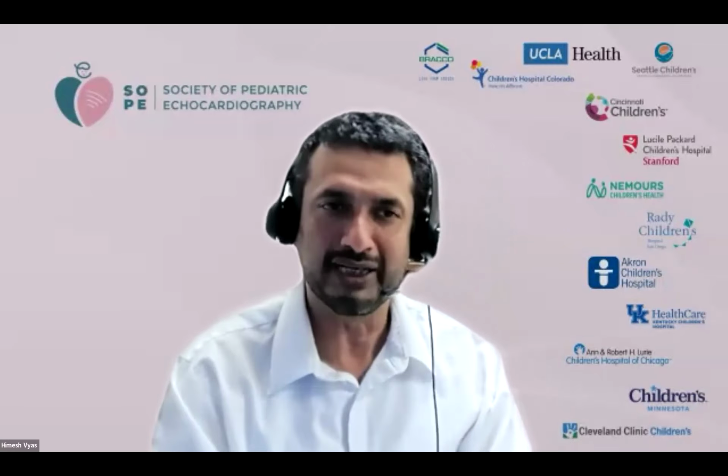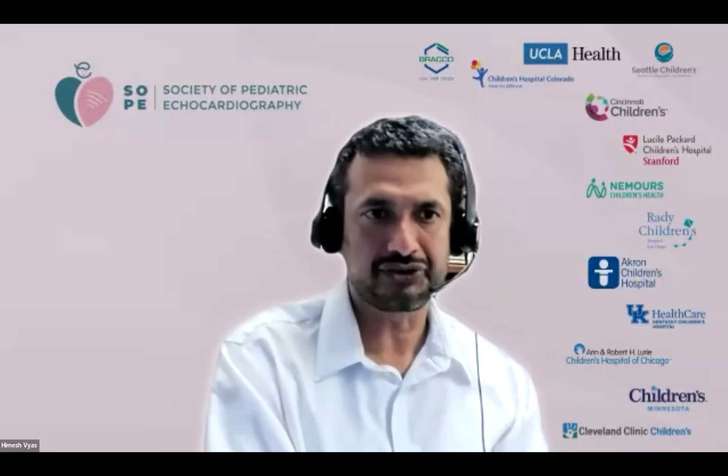Certainly, I'm sure Mike would be a great resource for that. But in my opinion, we tend to have a very low threshold to move from one modality to another. For example, if you're having trouble imaging part of the heart, and that is the part that is in question, we have no issue with switching to, say, epicardial echo, particularly for things like RV to PA conduits.